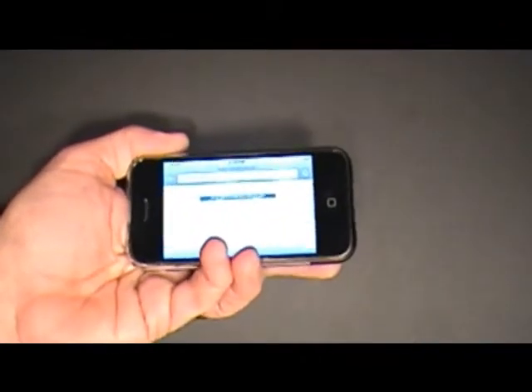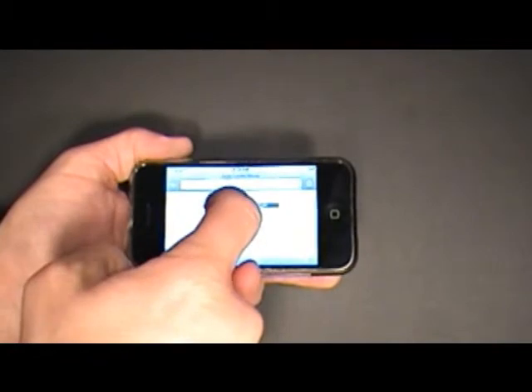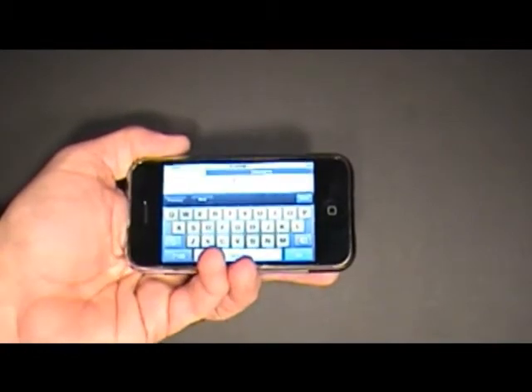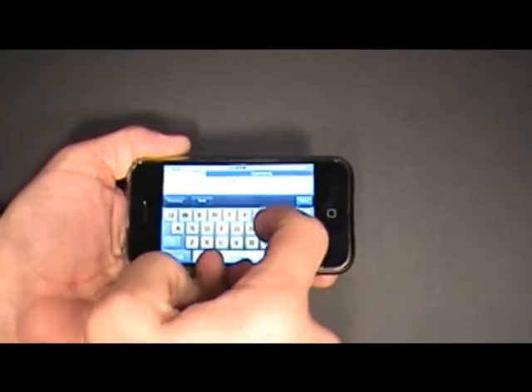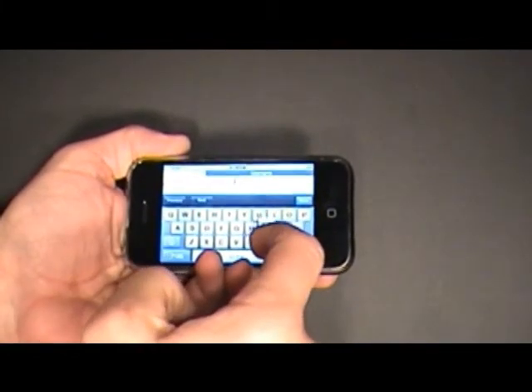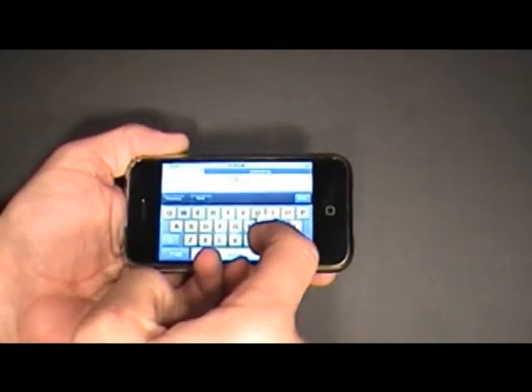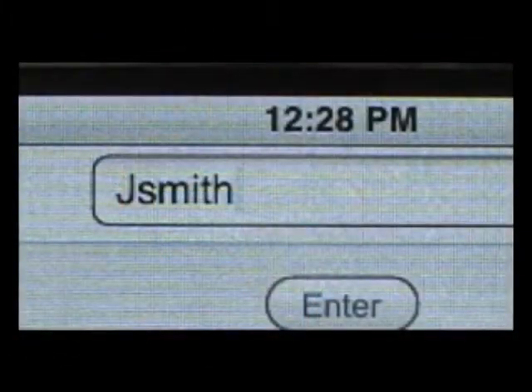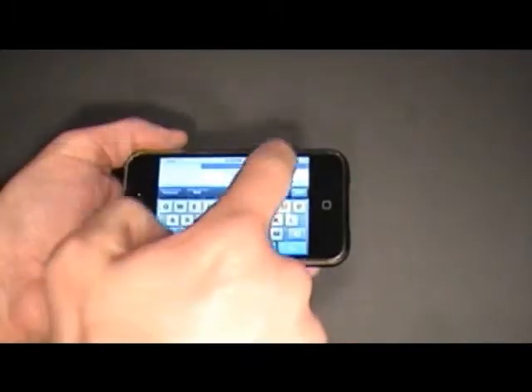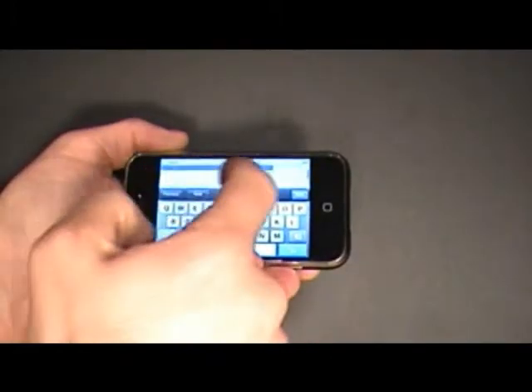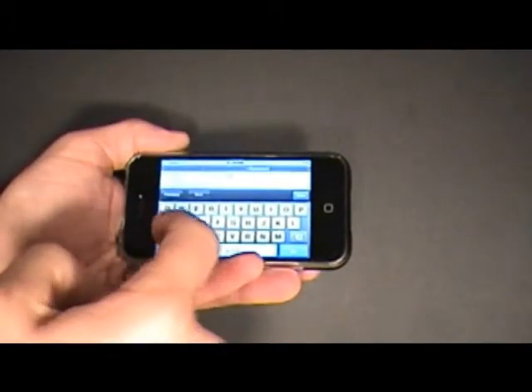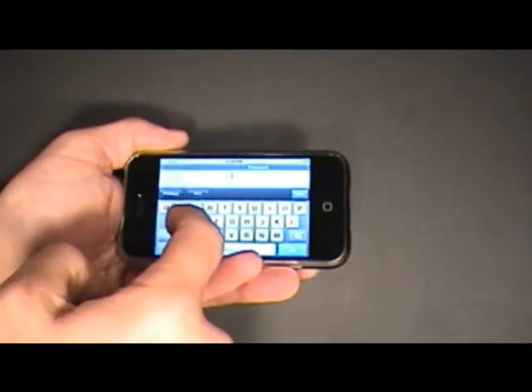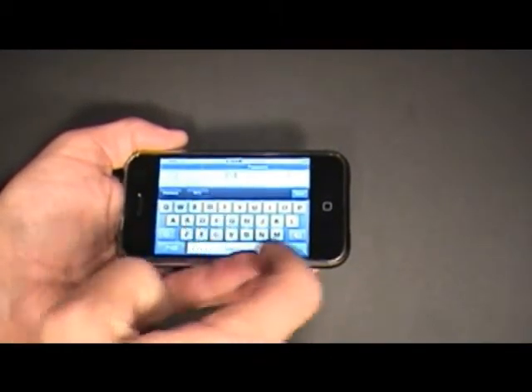First thing we'll need to do once we're in CardioServer is to log in. We'll enter our username, in this case it's JSmith, and then of course our password. And then we'll select Go.